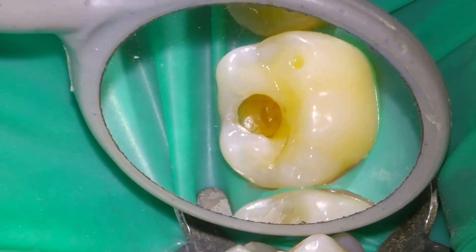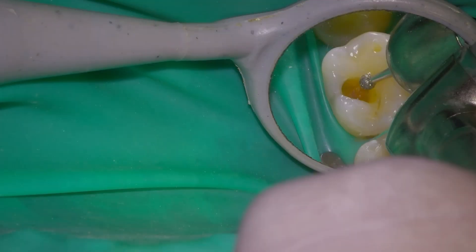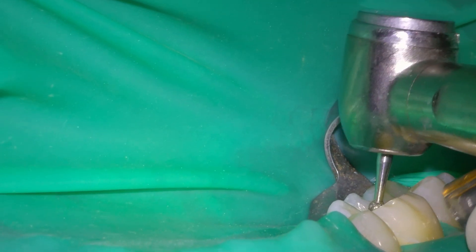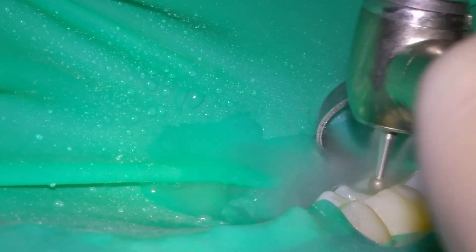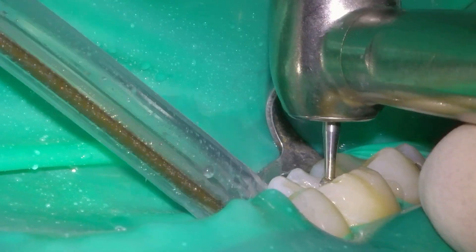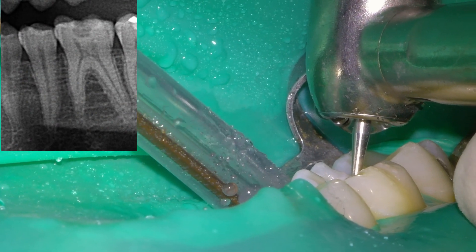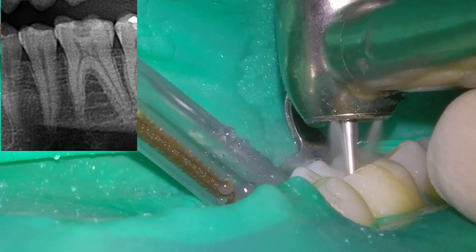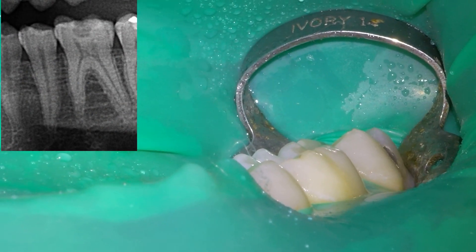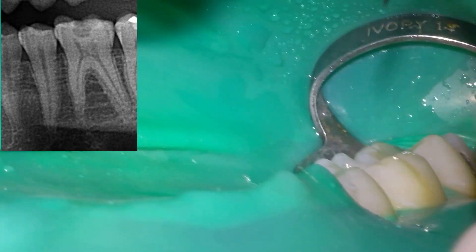Hello everyone. In today's video I am going to perform an access cavity of a lower first molar. If you look at the x-ray, it seems that the caries does not reach the pulp, but the patient was experiencing very strong and persistent pain when eating or drinking cold things.